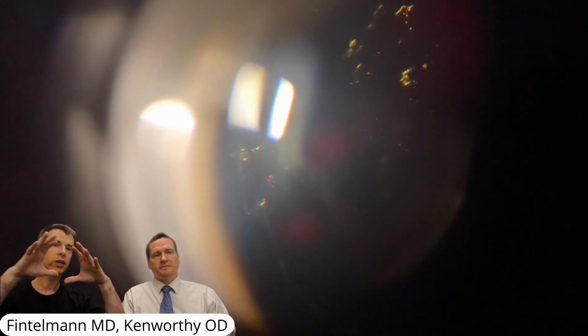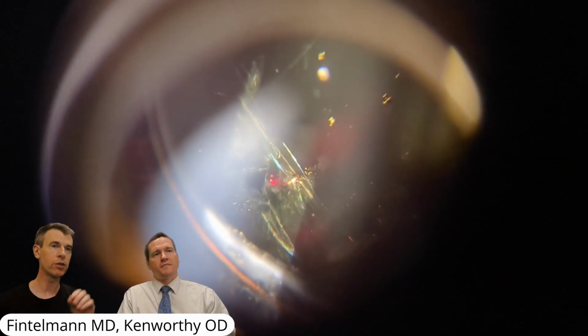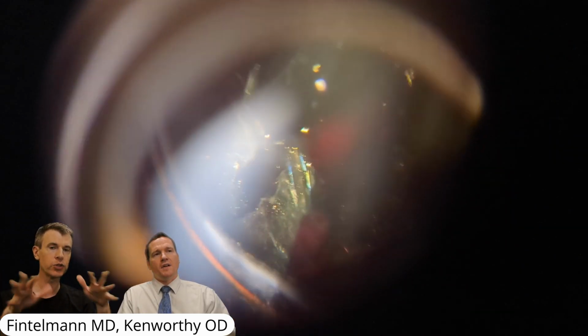This YAG, as you can see, I just do in the periphery because it needs to be larger. But the lens epithelium can also grow directly on the lens. So it's technically not a recurrent posterior capsular opacification, but a posterior opacification behind the lens. And the lens epithelium, when it grows on the lens, you will treat similarly using a YAG to remove it and push it into the vitreous.